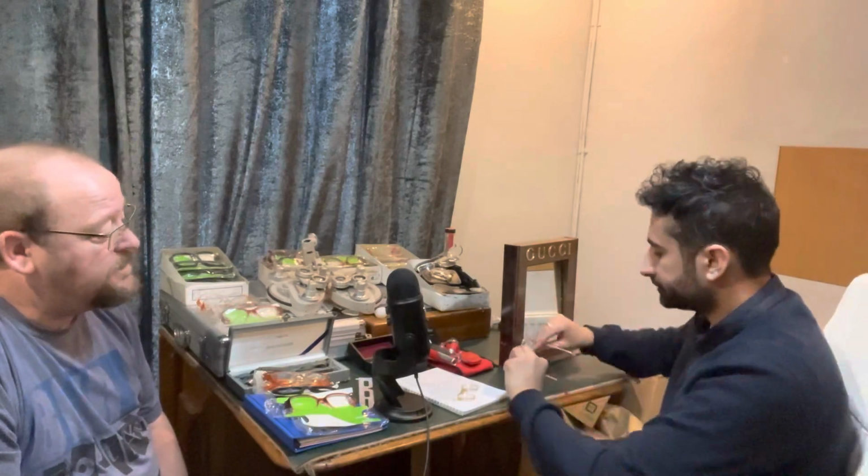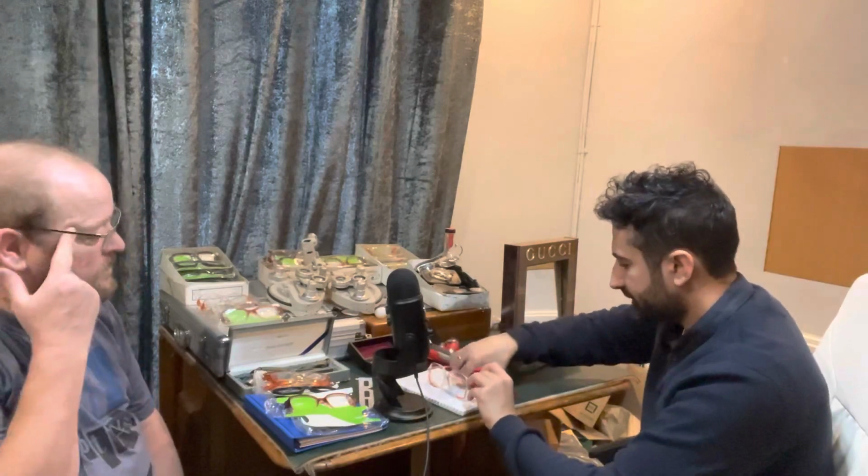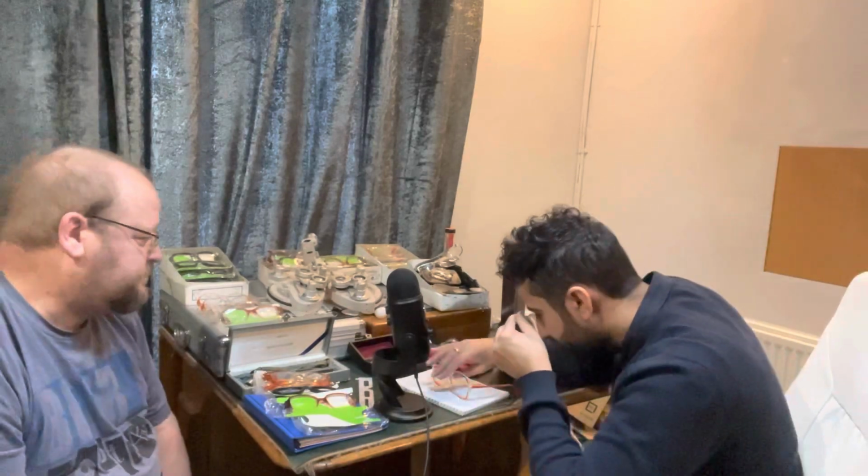When I get my prescription, they won't squeak like this? While it's new, they will squeak, they will settle down. A little trick when we're glazing it is we just rub it with some talcum powder, and that usually stops that happening. Let's have a look at this one side.